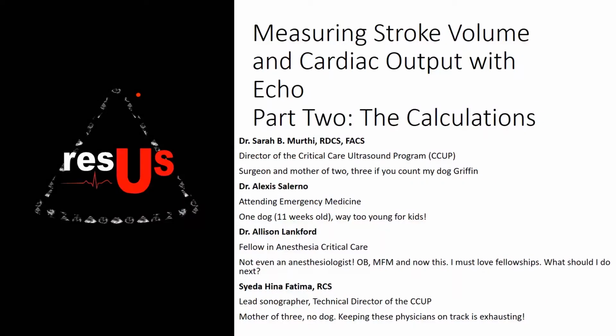Welcome to our Level Up series part 2. We'll be talking about stroke volume and cardiac output with echo and how you do the calculations themselves.